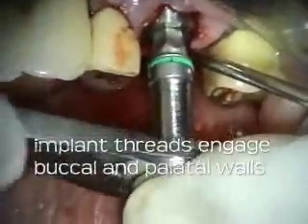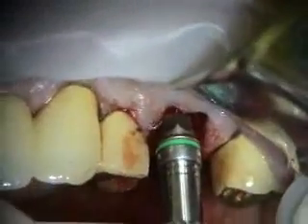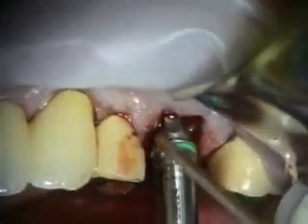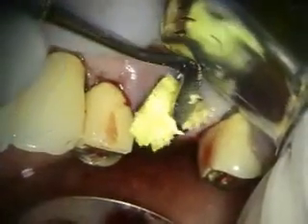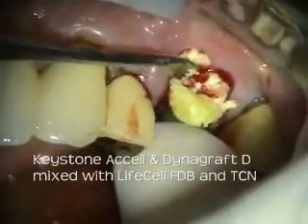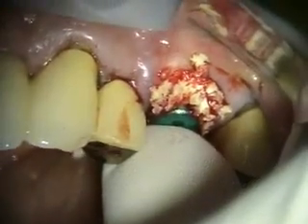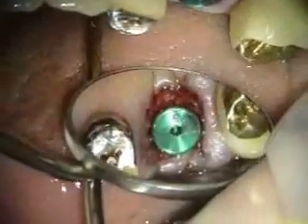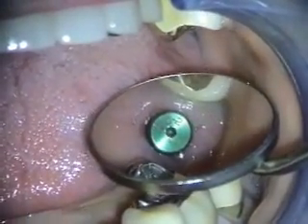A lot of pressure. This is a two-week healing of the immediate implant in the number 14 site. Take a look at the x-ray next.